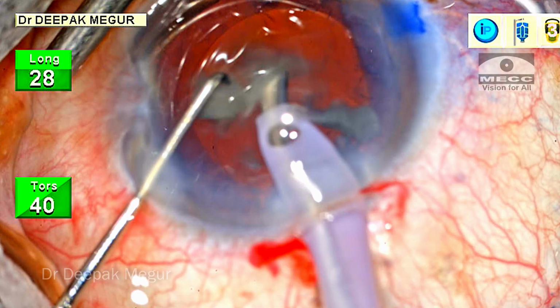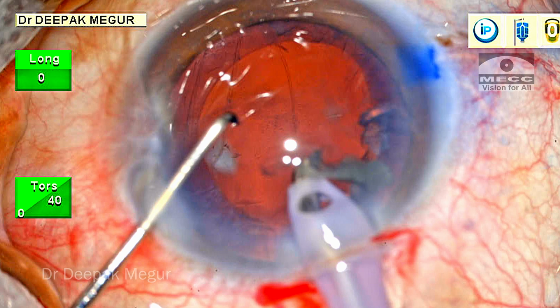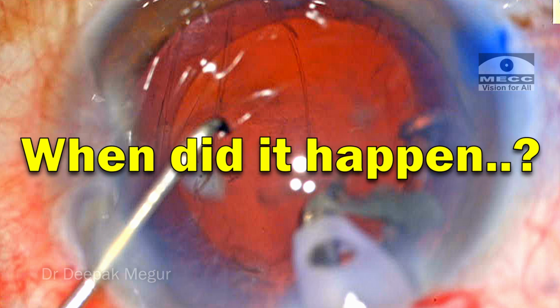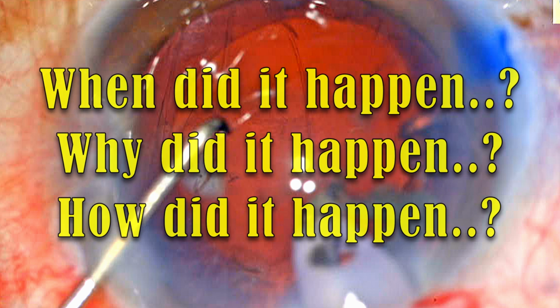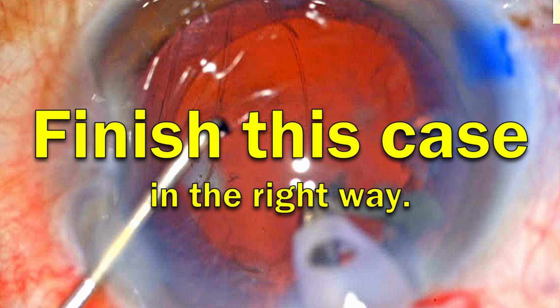This is not usual. Well, in a few seconds, it becomes very obvious that a large PC tear is staring at me. And at this point, a million questions are bombarding my head. When did it happen? Why did it happen? How did it happen? Well, at that point, these questions can always wait. The first thing I need to tell myself is that I have a job at hand and to finish this case in the right way.